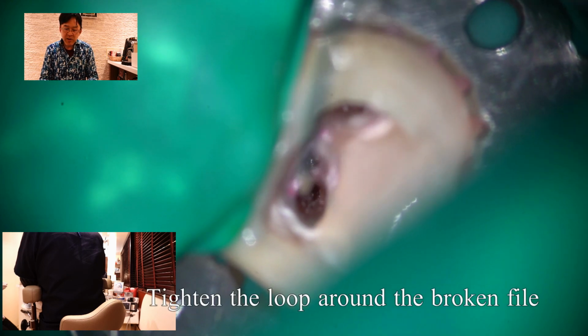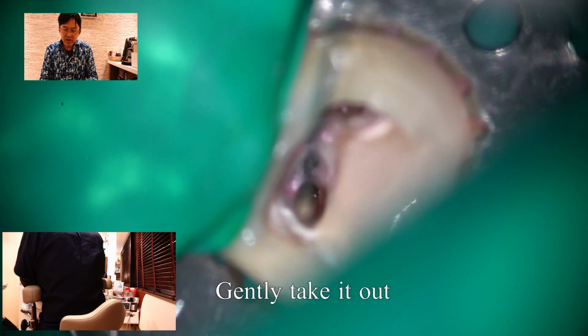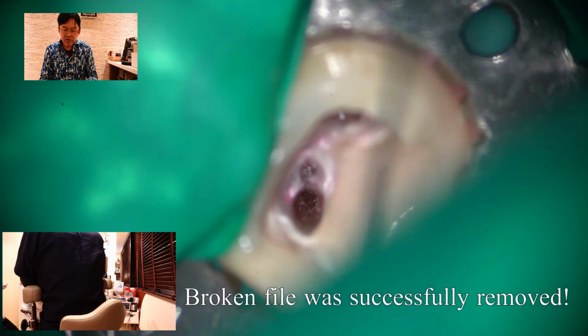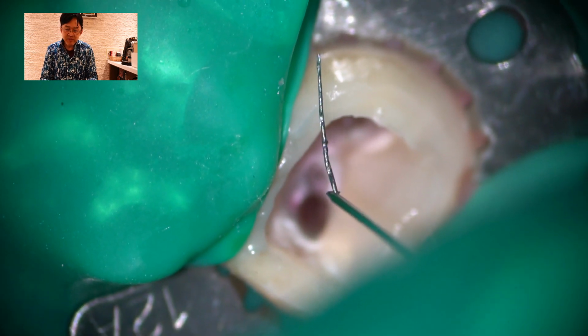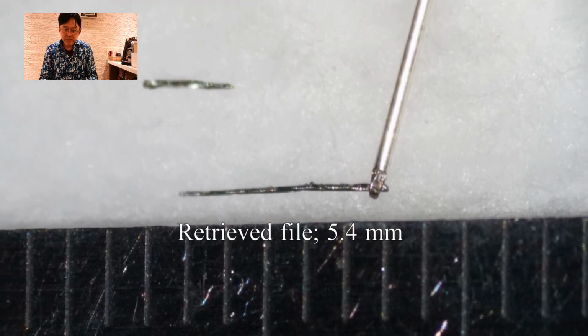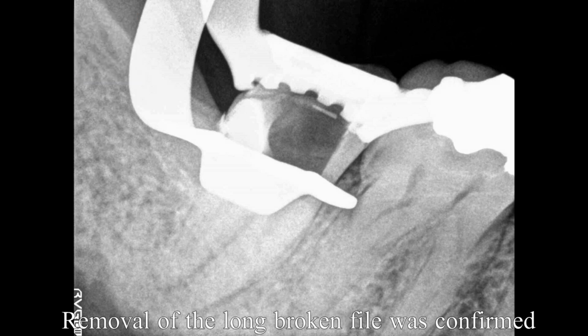So I like to give it another try. Place it and tighten it around the broken instrument and gently take the broken instrument out. Now it was removed successfully. And the instrument was actually 4.5 millimeters.